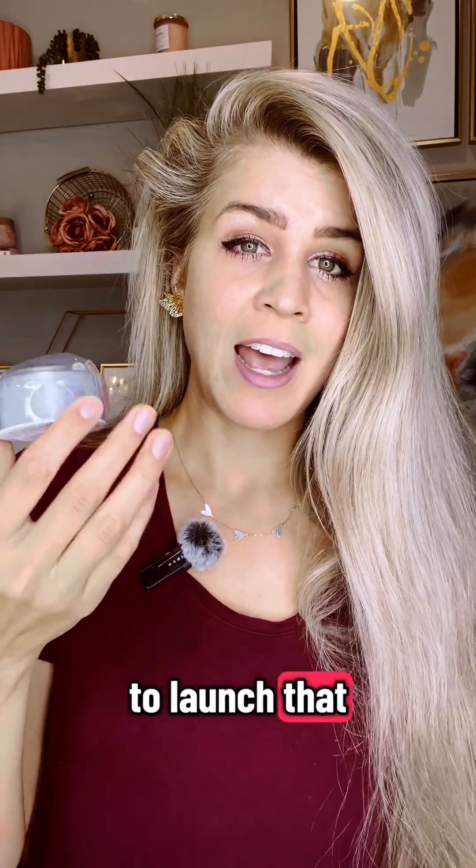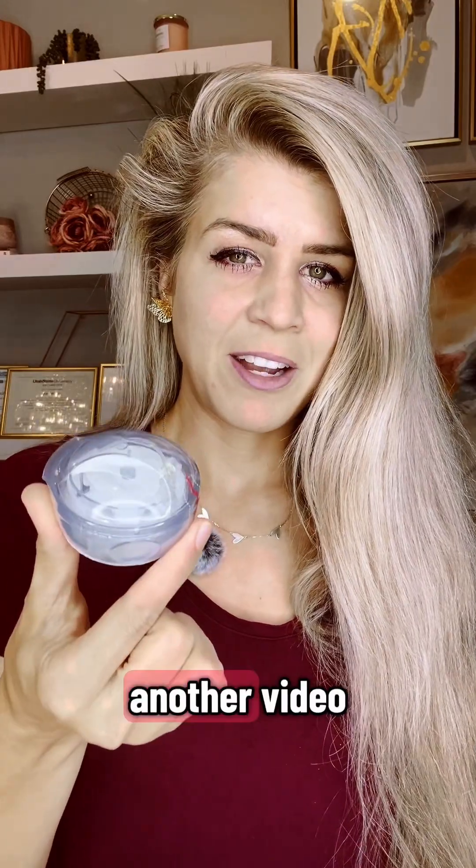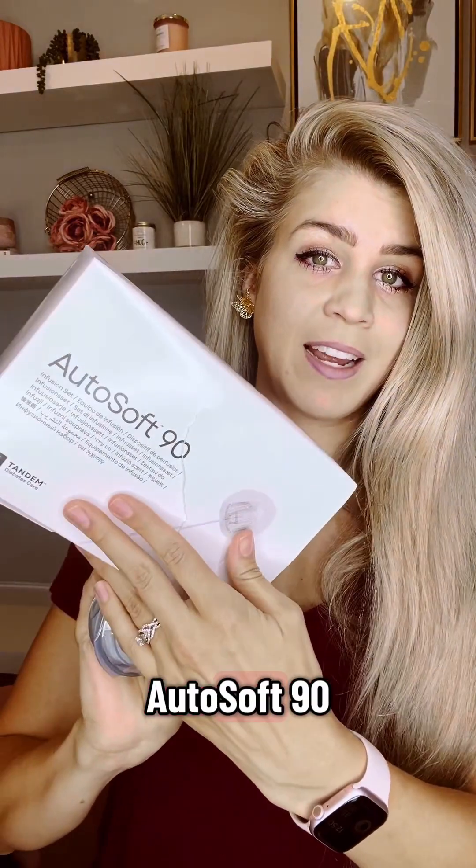They're hoping to launch the Steady Set at the end of this year or early next year, which is really exciting. I will go over how to use it in another video. This AutoSoft XC is just a 90-degree angle — very similar to this — you also have the AutoSoft 90.